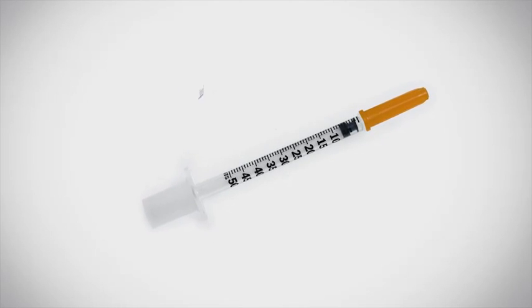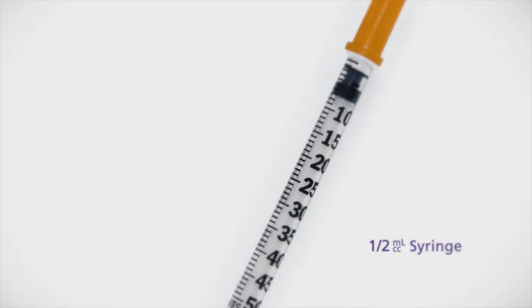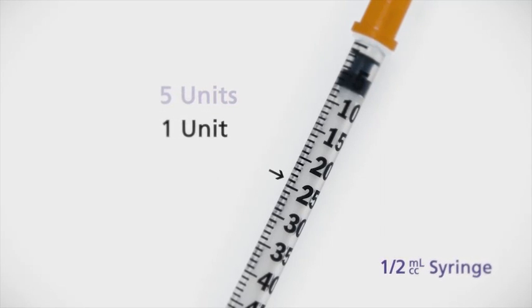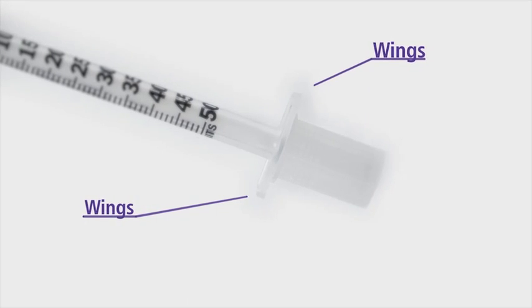Before I continue, I want to make sure you're familiar with the parts of the syringe. The largest part, called the barrel, has markings that are used to measure your insulin. A half milliliter barrel can hold up to 50 units. The long lines mark every five units, and the shorter lines in between indicate single units. The barrel has wings, or flanges, on the bottom to help you hold the syringe.